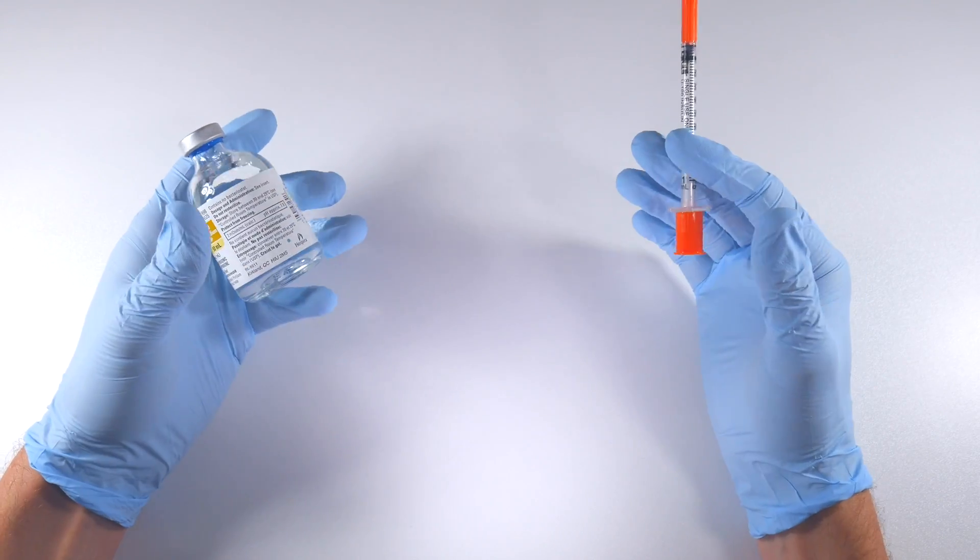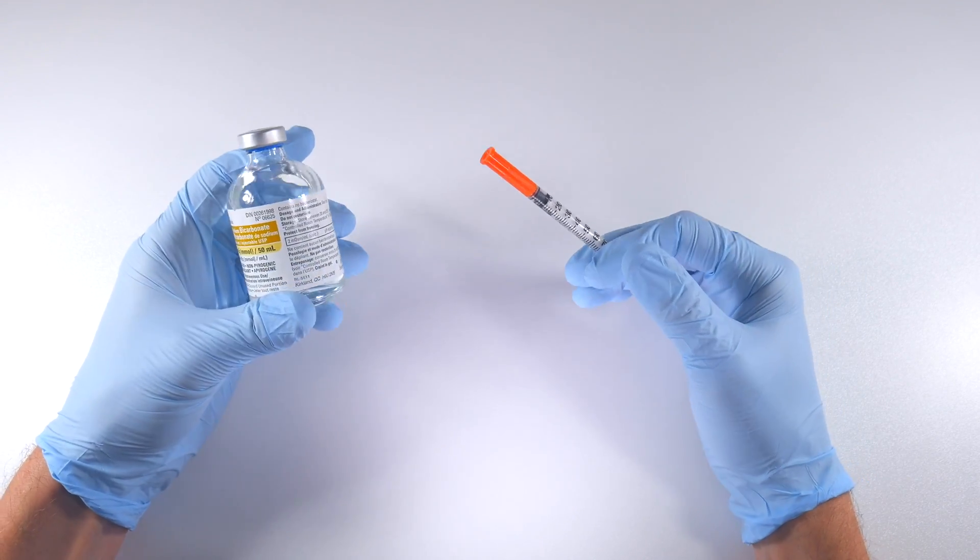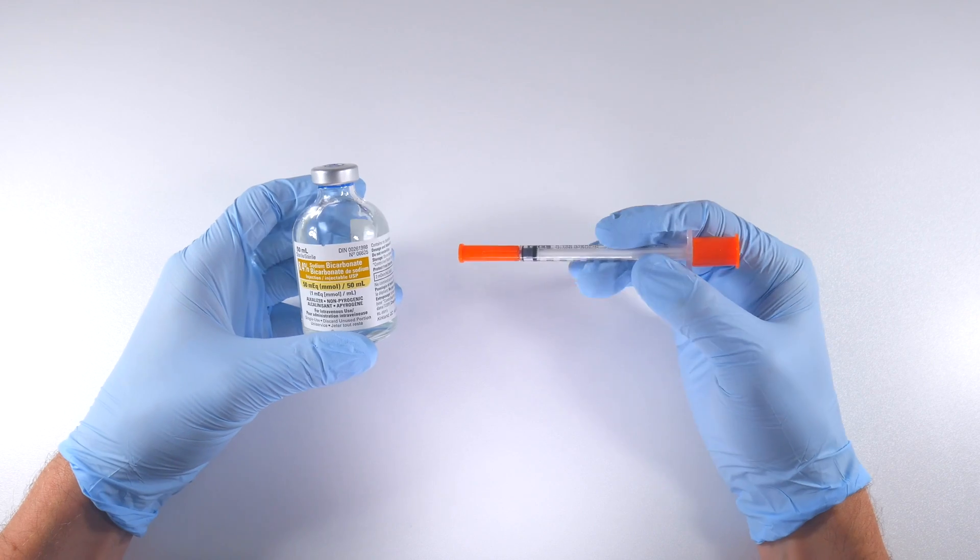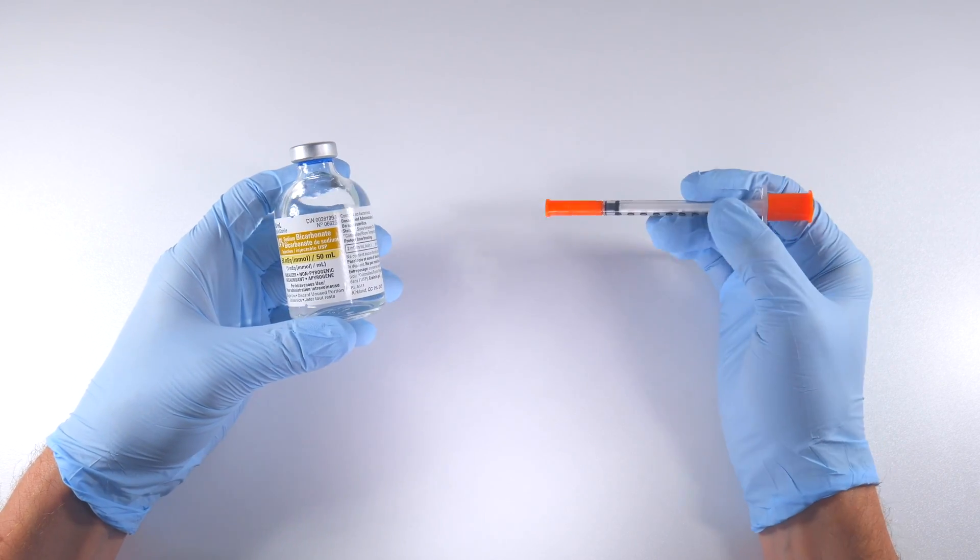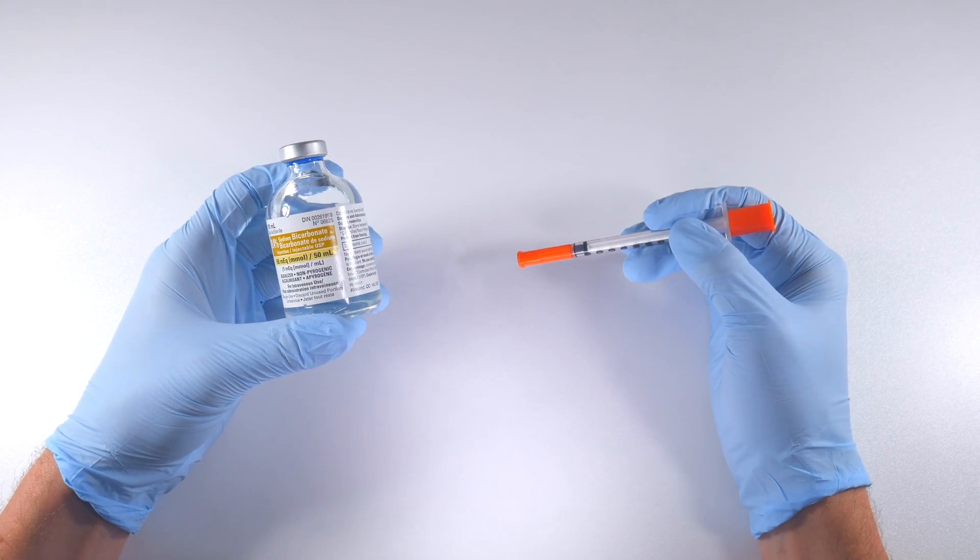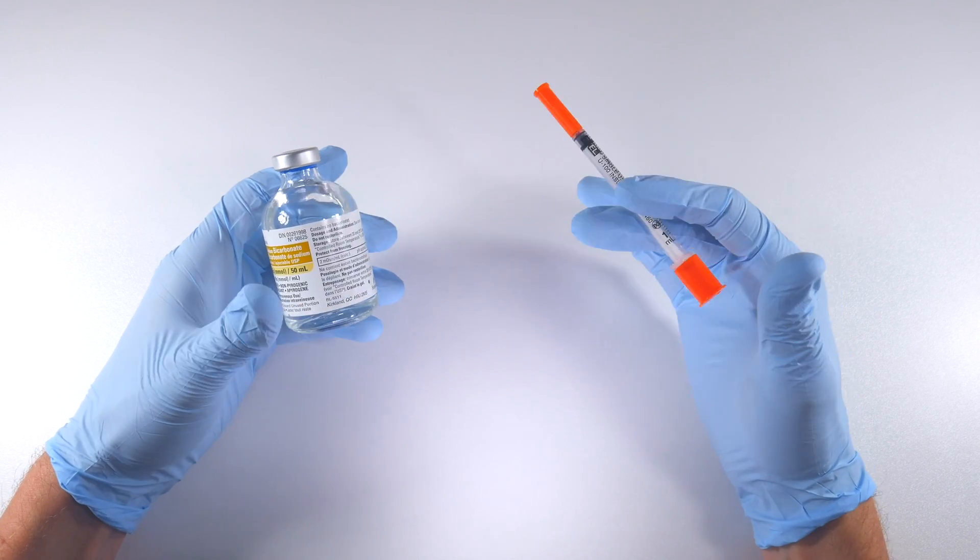So that's it. That is as simple as I can get. So basically I just demonstrated to you a way that you can quickly and effectively do this chairside and have great results.